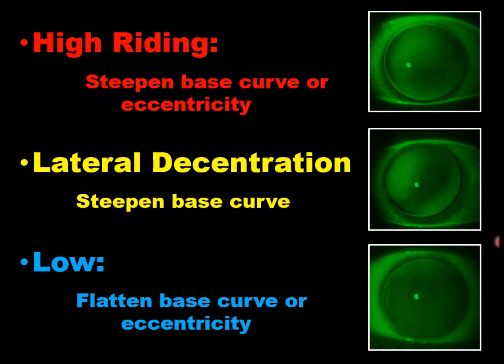Your consultant can assist you with this process of evaluating the fluorescein together and alongside the centration of the lens. It can usually tell you which direction that we need to go. So employ your consultants to help you through the entire process.